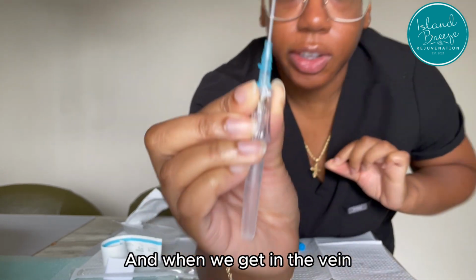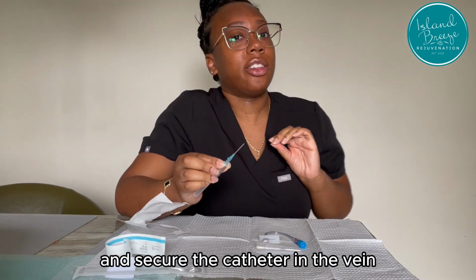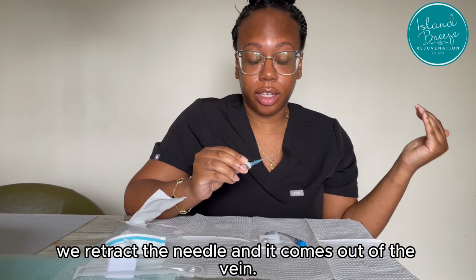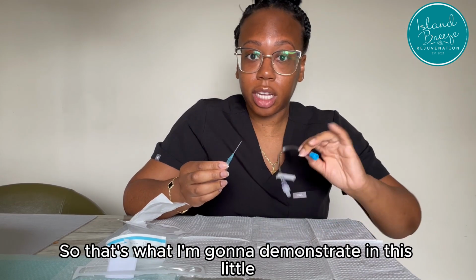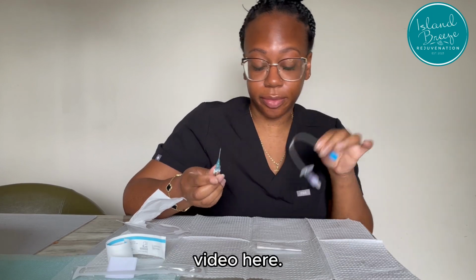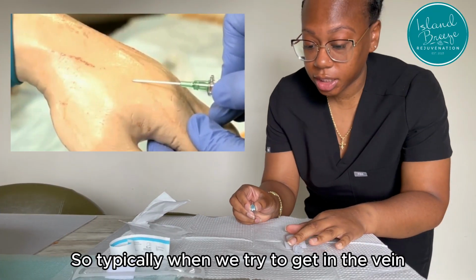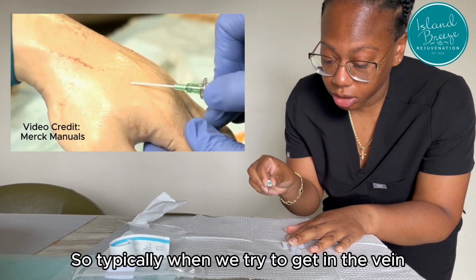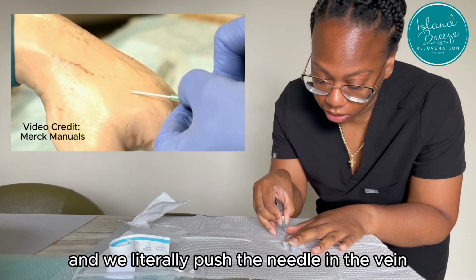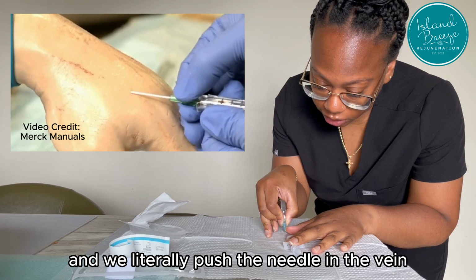And when we get in the vein and we put the catheter and secure the catheter in the vein, we retract the needle and it comes out of the vein. So it doesn't actually stay in there. So that's what I'm gonna demonstrate in this little video here. Typically when we try to get in the vein, we keep this like how it comes, and we literally push the needle in the vein.